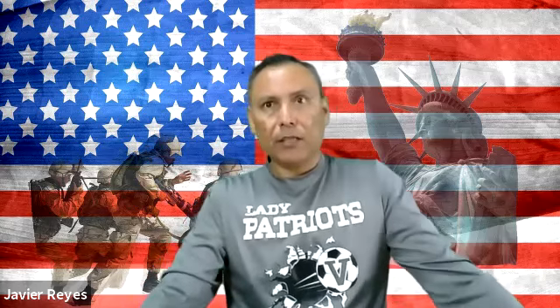Okay. Number 14. Which of the following specimens can be centrifuged immediately? We said some specimens can be centrifuged right away as long as they are in an anticoagulant tube, right? Would it be the electrolytes collected on a PST? Yes, that's correct. Wow, you're good, Erica. 15. The difference between barcodes and radio frequency identification is?